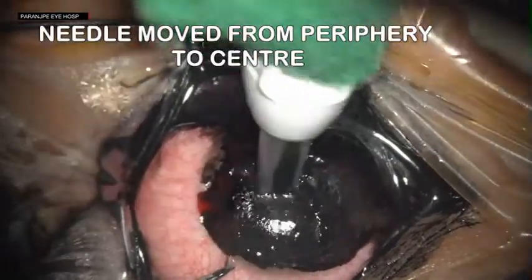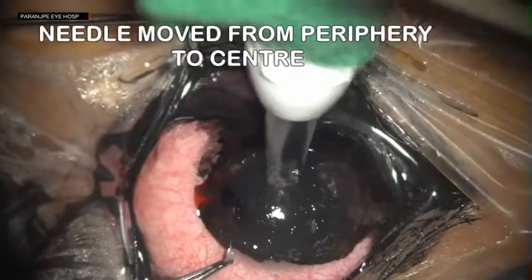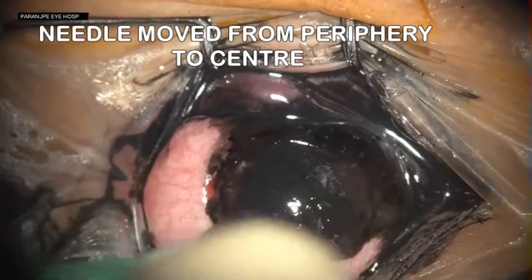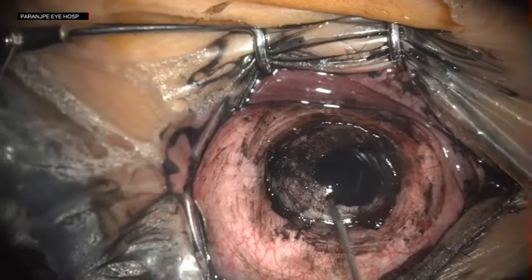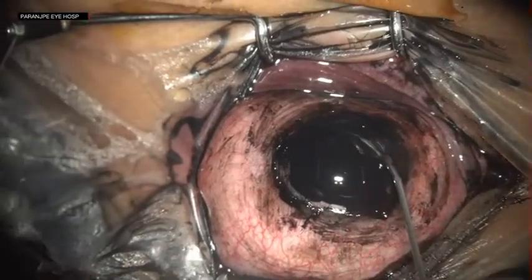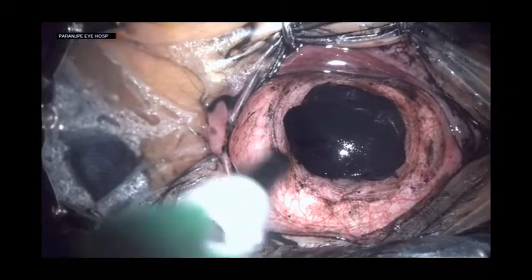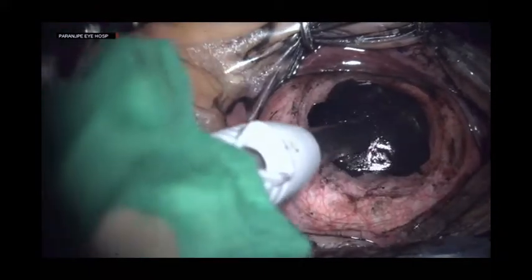You will have to repeat this procedure three to four times so as to get a good uniform pigment spread across the corneal stroma. The pigment is reapplied and again the tattoo needle is used to create micropunctures and push the pigment into the stroma.